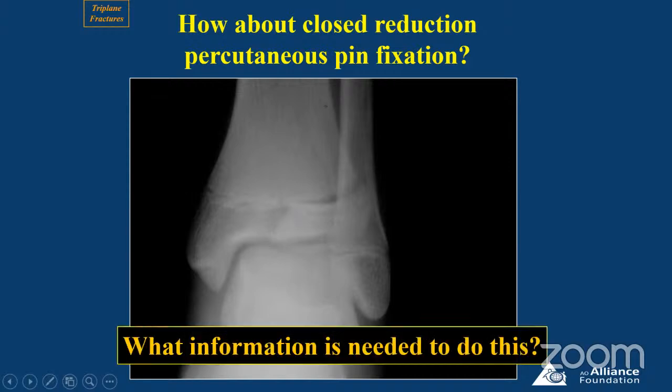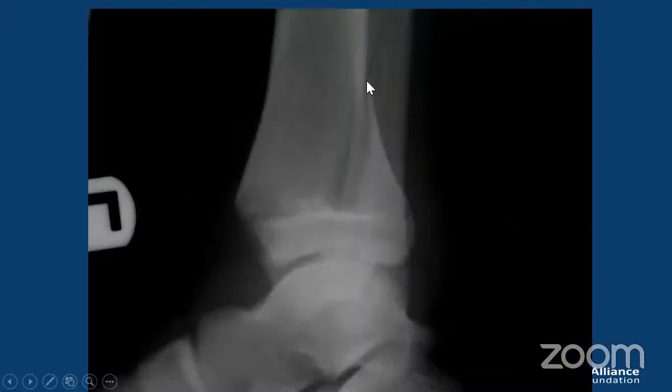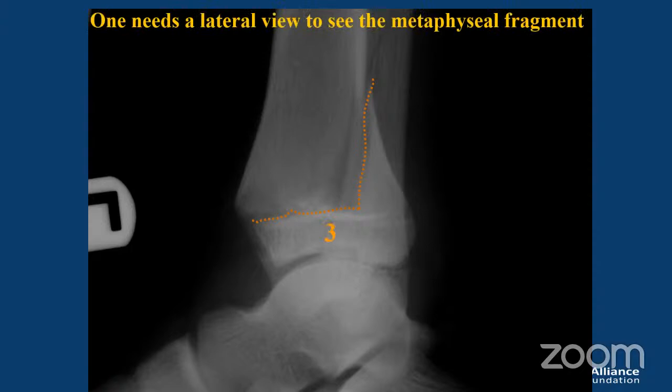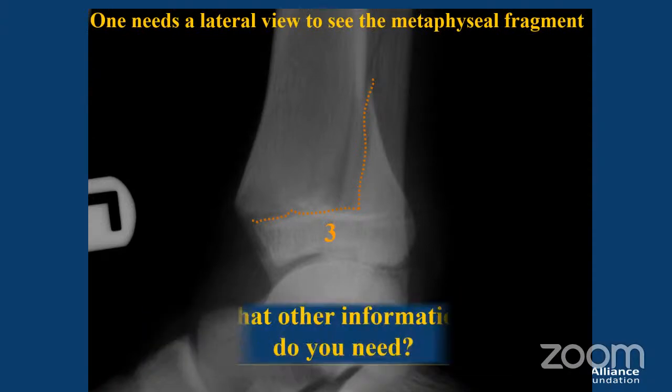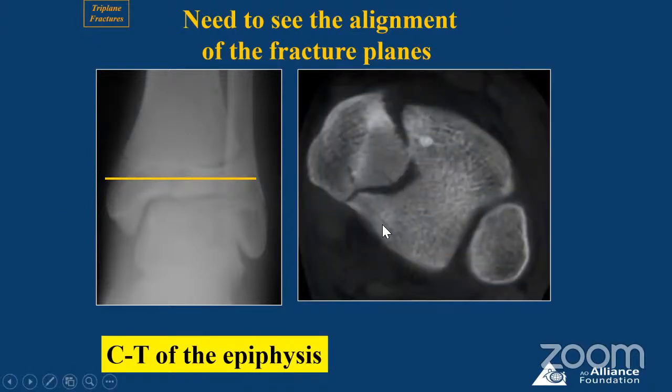What are you seeing on lateral? Okay, you see that this is one plane. The second is going to go across horizontally, and the third in the lateral will be vertical. Okay, so these are the three planes of the triplane fracture. And you will know the directional displacement on a CT scan. Okay, so you take a lateral, but always get a CT scan. Okay, CT will show when you take a cut of the CT through the epiphysis, what do you see? This is what you see, a sagittal fracture. Okay, these are the two fragments.